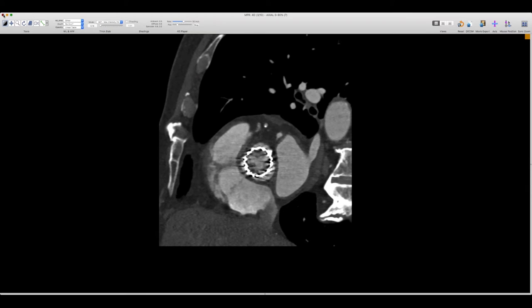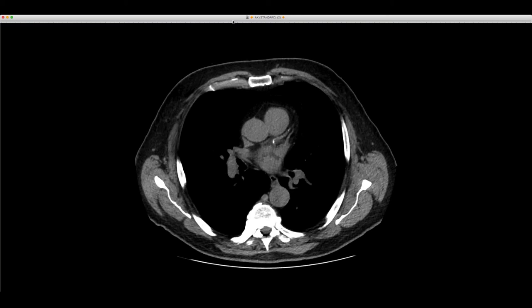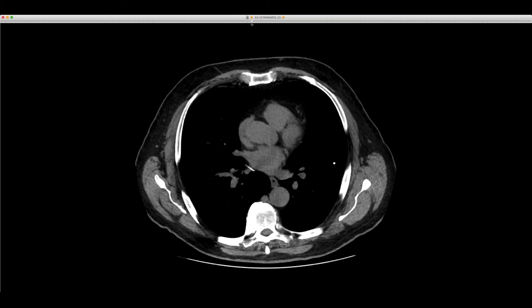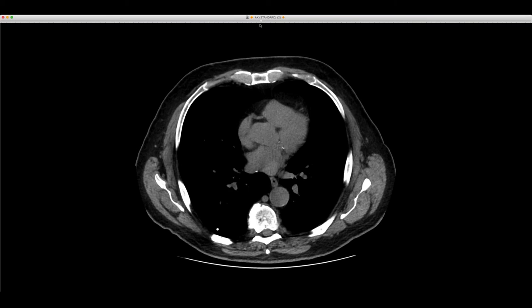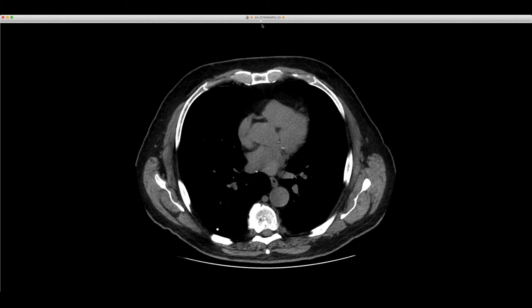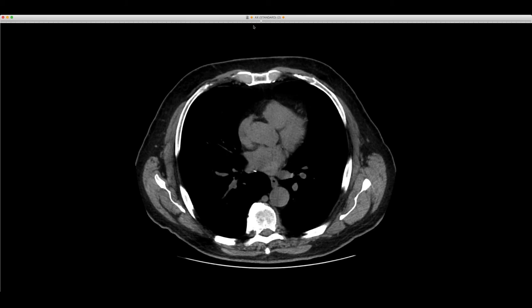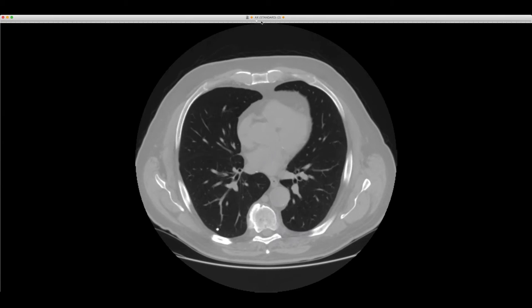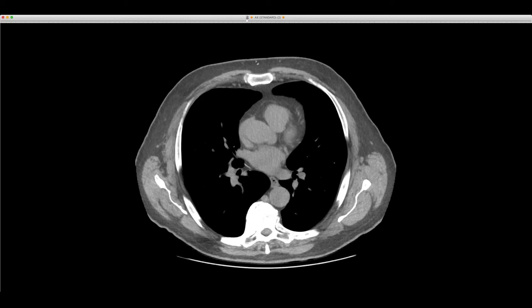Let's take a look at the chest CT first. Let me make sure I'm showing this. Okay. So this is a patient who came in with a prior history that I'll withhold for a second, but as I'm adjacent to the right inferior pulmonary vein, you can see there's a linear object there. I'll change it to an intermediate window here, and you can see that this is abutting the inferior pulmonary vein, not quite within the pulmonary vein. It's sitting in the mediastinal fat there.